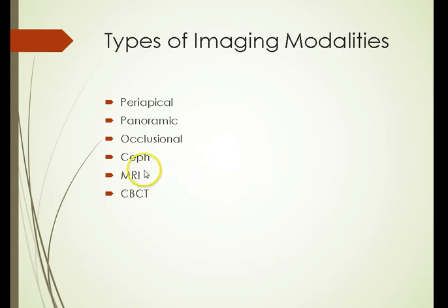We can cross out, at least, MRI. For lecture's sake, we can talk about it. But again, for implant's sake, there's really not much use, especially how expensive these are. Ceph, same thing: the amount of information you're going to get versus the amount of radiation you're going to get, and the money spent would not give us much.